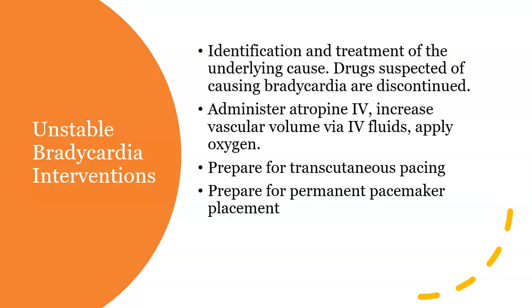You can do transcutaneous pacing with a defibrillator. There's a setting on there. So we may be assisting while they are pacing that patient. Preparing for a permanent pacemaker, we said. So again, we can attach those transcutaneous pacers that are going to help stimulate those heartbeats. We can set it at 70 and it will stimulate the heart if it is beating less than 70 beats per minute to make up those beats.